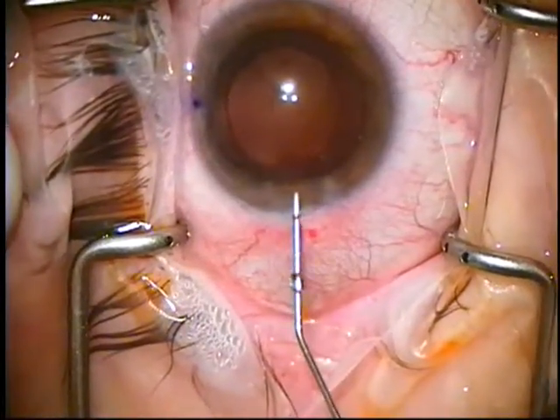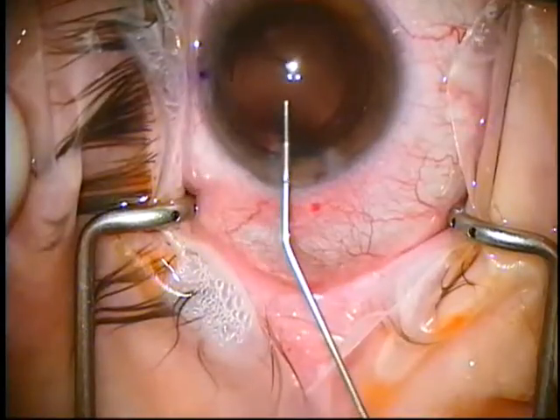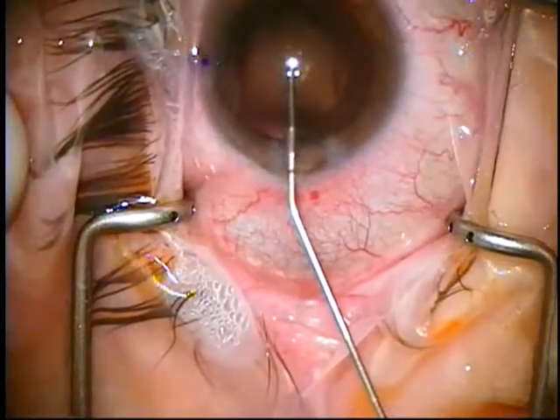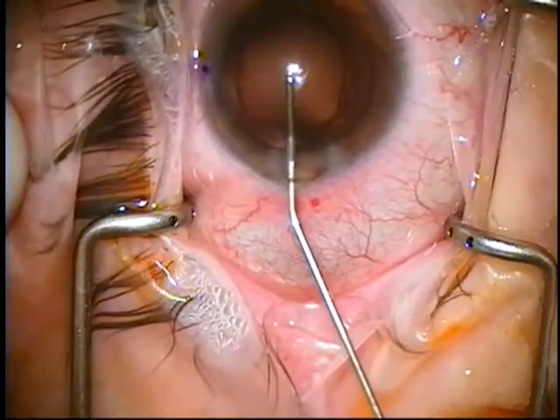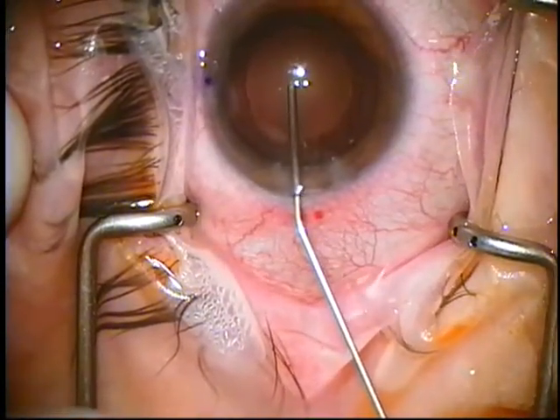Now we're going to put the Provisc in. Let's inject a little to keep the iris out of our way, and we advance as we inject. Go dead center with a subtle tilt down. You can see that shine off the posterior capsule, but I'm not really touching it. I want to make sure this goes in the bag, not over the bag.